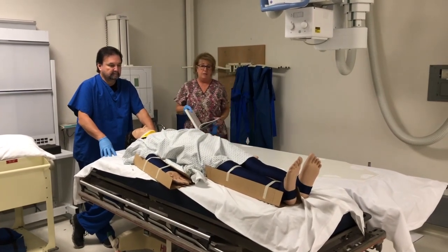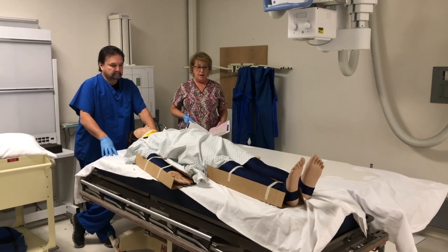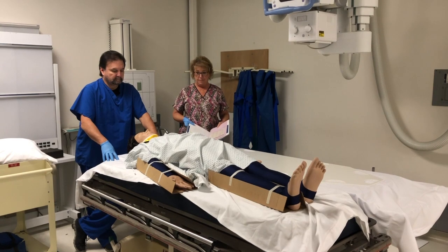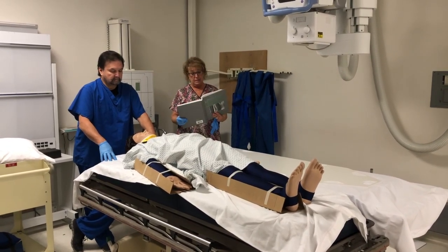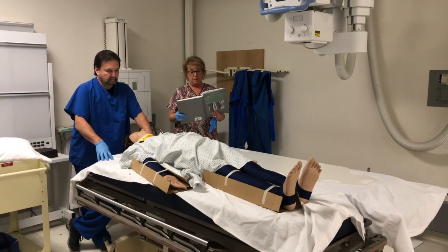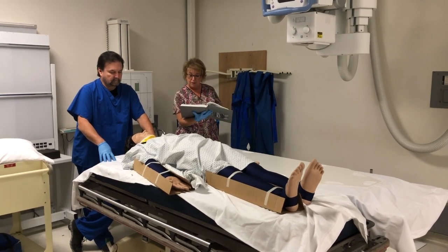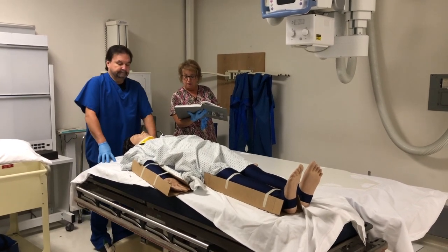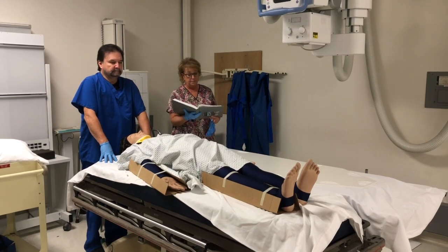So we're going to talk about trauma considerations today and dealing with a patient who has had some sort of trauma. We're using our mannequin today to demonstrate. And in your book it says the definition of trauma is severe injury or damage to the body caused by an accident or violence. Most common are falls, followed by motor vehicle accidents, and then firearms rank last in cause of injury, however, they're normally fatal.